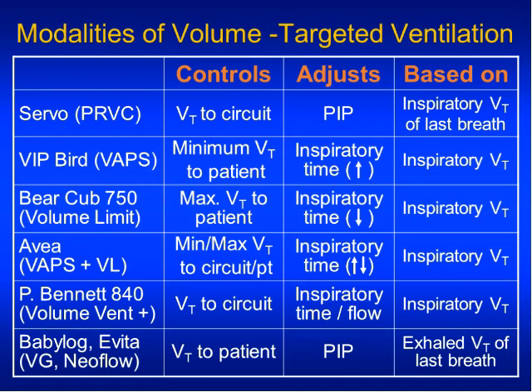So to try to get around these issues, folks have come up with modifications of pressure-controlled ventilation that alter some parameter to try to target a set tidal volume. In essence, you can either alter the inflation time or the inflation pressure.